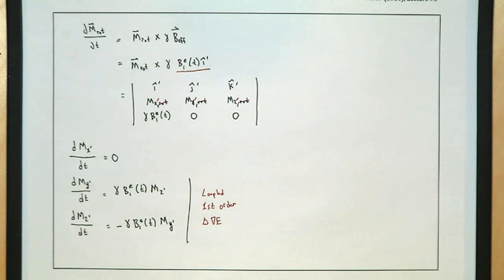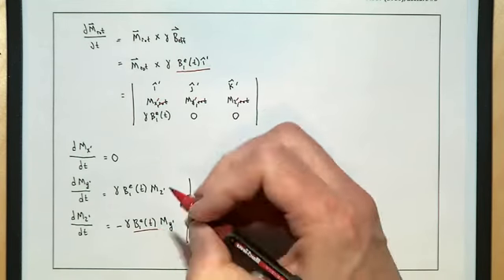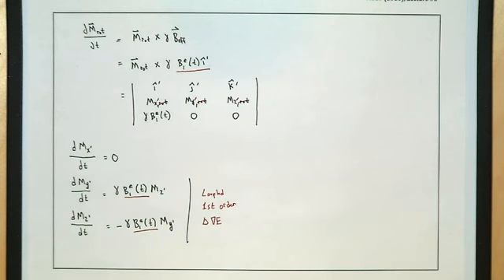Given the time, I'll go ahead and wrap it there. What we'll do when we come back, it'll probably be one of the first things that we do. We'll work through a specific solution to this expression here, where the interesting thing now is that this B1E of t term and this B1E of t term, of course, the same thing, are now functions of time, so we can't just throw in a constant when we look at the solution.